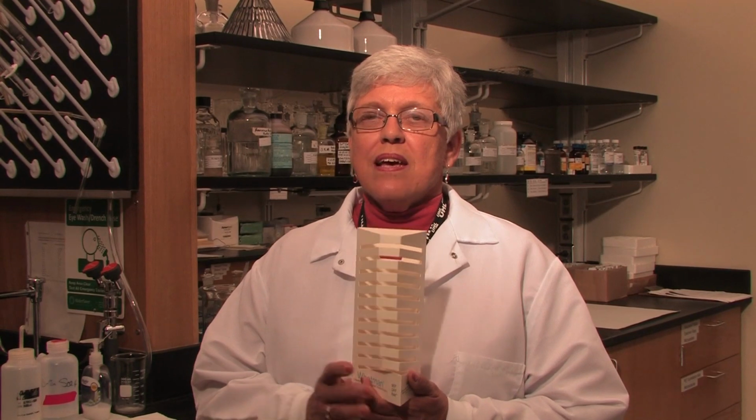Once a blood spot specimen is collected, does it need to dry before being sent to lab? Yes, it needs a minimum of 3 hours for drying time, and then it should be sent to the lab within 24 hours after being collected. One of the items that's available is what's called a drying rack, and that way you can put those specimens on there so that they're not touching anything, they're not on the bench, because any of those touching each other can cause contamination, or putting on a bench can cause contamination. And so you can set them in here, let them dry for 3 hours, and then send them.